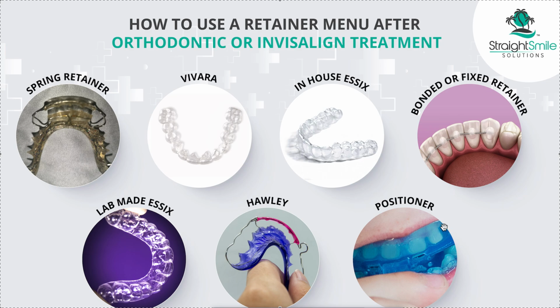You can't talk with it in. It's a one-piece mouthpiece. I know that this is actually an eruption guide appliance. This is like a pedo version of it because I really couldn't find a positioner. My son has one somewhere in his closet because we did make him one by TP, but I couldn't find it. Just to clarify, there are semi-custom and custom positioners. I'm going to assume you're going to be doing custom. The only person that can make a custom positioner right now, the patent goes to TP Orthodontics.